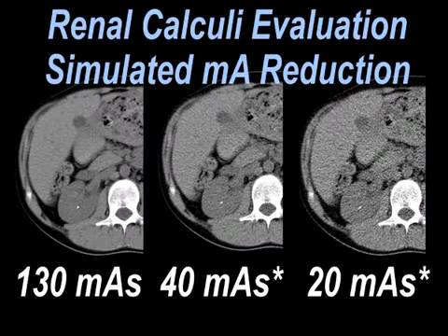Another examination, this goes back to the simulation technology I talked about where we add noise. This was a child with a kidney stone, and you can see it's a fairly high contrast abnormality we're looking at here, but as we add noise and as we get to 1/6 of the original dose here, we can still see the stone quite well. So kidney stones are something else that are amenable to a lower dose examination in children.